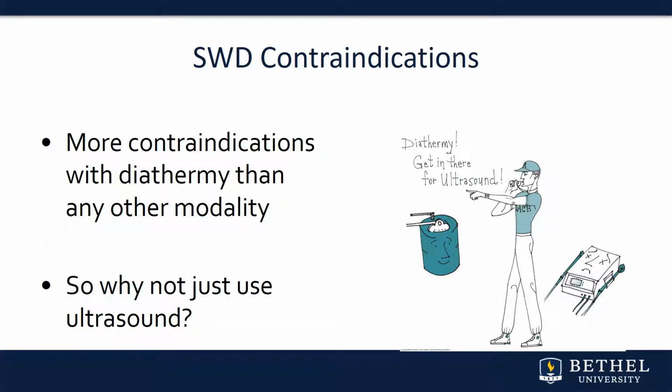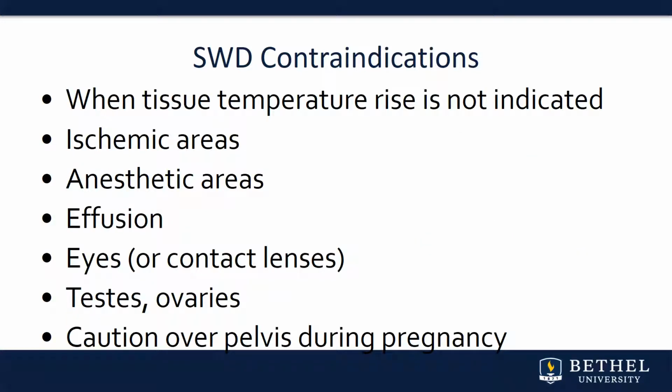As far as contraindications, there are more contraindications with diathermy than any other modality. So you might say, well, let's just use ultrasound because we don't have to deal with the contraindications. Well, if you have a large area that you need to heat, the ultrasound becomes very tedious and you end up overusing it. So it's a good modality, but used in the right timing. So let's go to the contraindications.